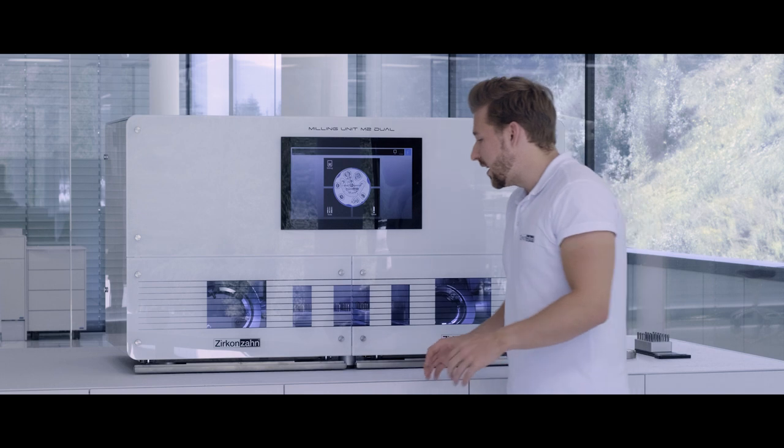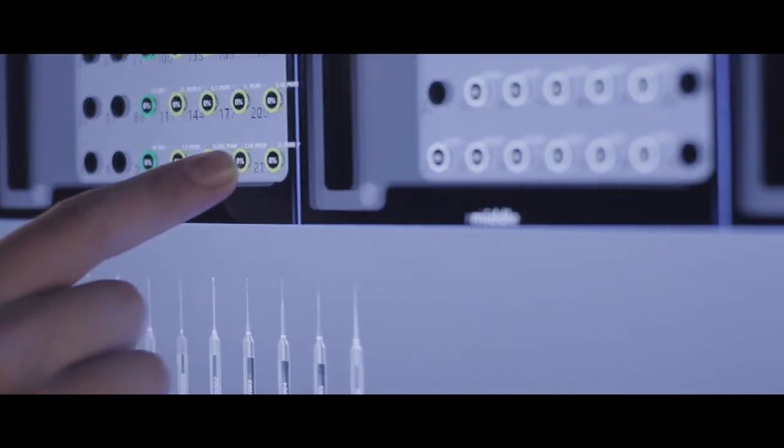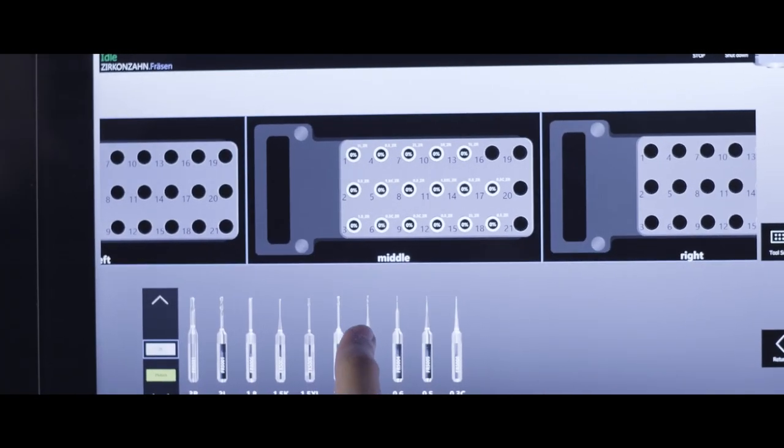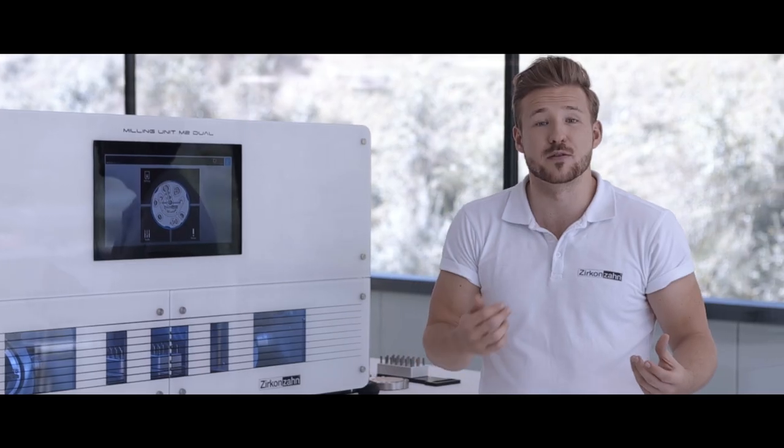Because we no longer have a mouse or a keyboard, we also designed a new touchscreen surface for the milling software, making it easier to select new burrs, select new blanks, and of course to start your CNC files.